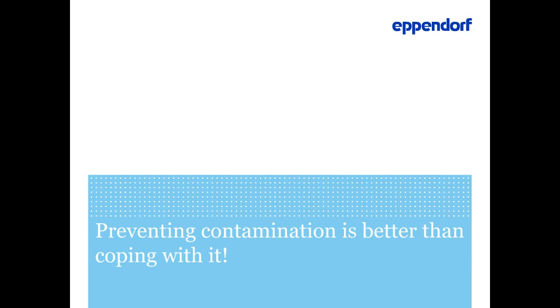Okay, then another question was regarding the FBS. Is heat inactivated better? Yes, heat inactivation is better than non-heat inactivation, but you want to make sure that it definitely is filtered and not only heat inactivated.